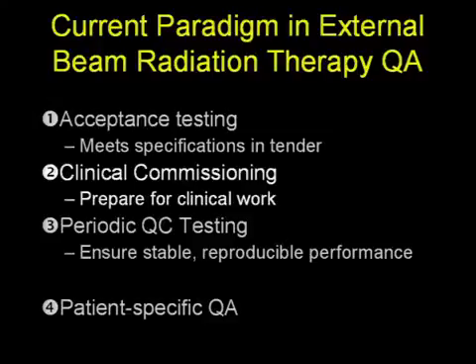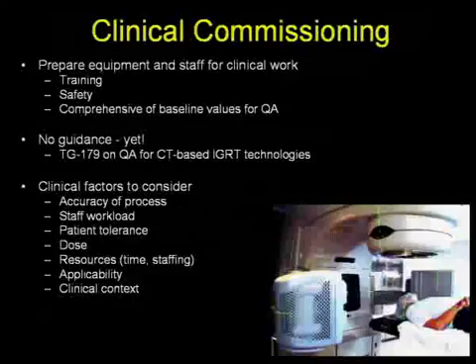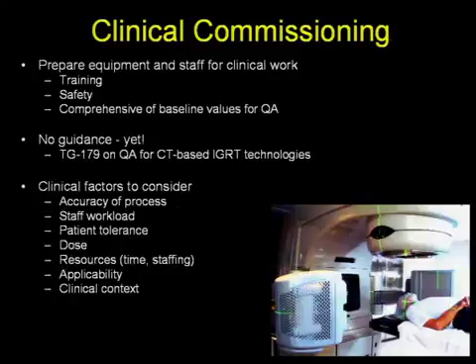So moving on to clinical commissioning. The aim of clinical commissioning is to prepare the equipment, but also the staff, for clinical work using the new technology.